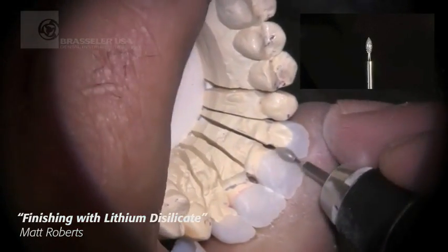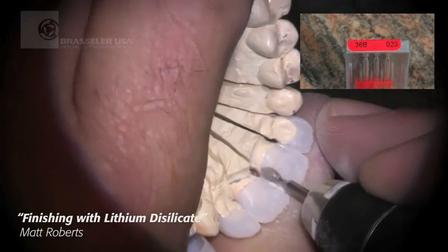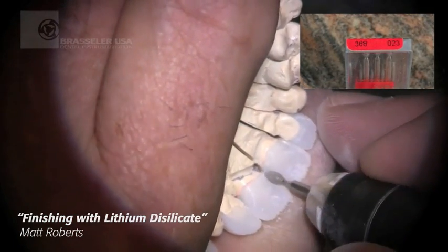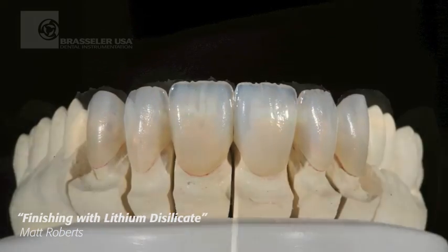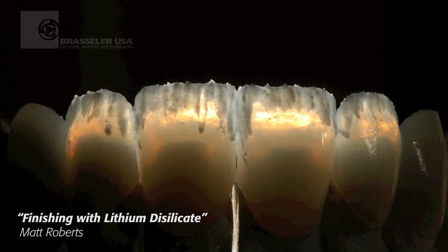I don't want to worry about those chipping. Here I'll come back on the lingual and jump back in with my 8360/8 bur in an 012 size to finish out the lingual. You see the result of the initial finishing prior to layering.